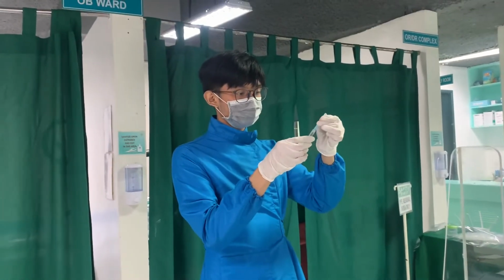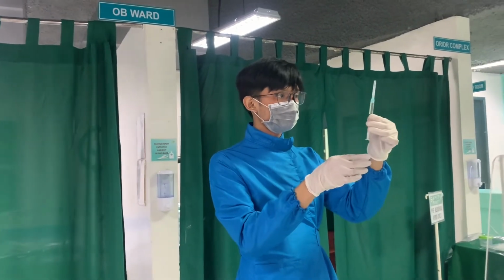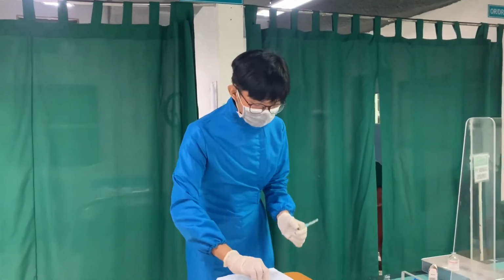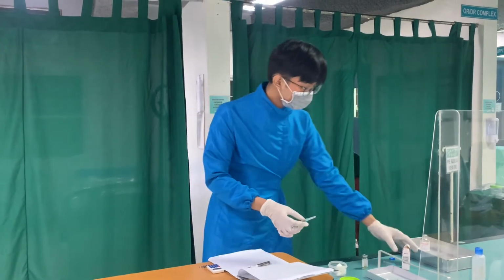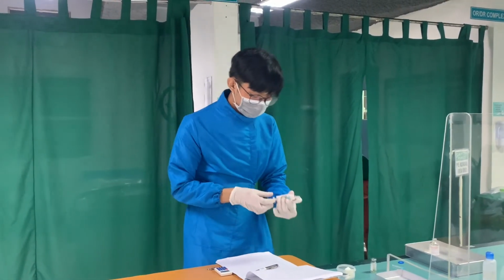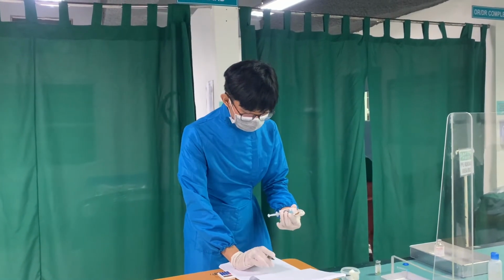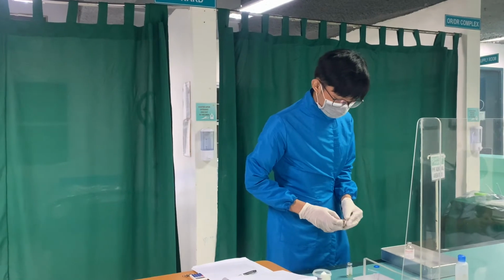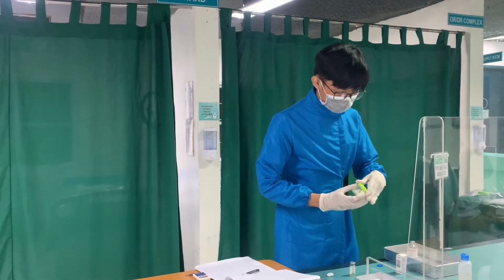After the correct dose is withdrawn, remove the needle from the vial and carefully replace the cap over the needle. If a filter needle has been used to draw up the medication, remove it and attach the appropriate administration device. Some facilities require changing the needle, if one was used to withdraw the medication, before administering the medication. Check the amount of medication in the syringe with the medication dose and discard any surplus.